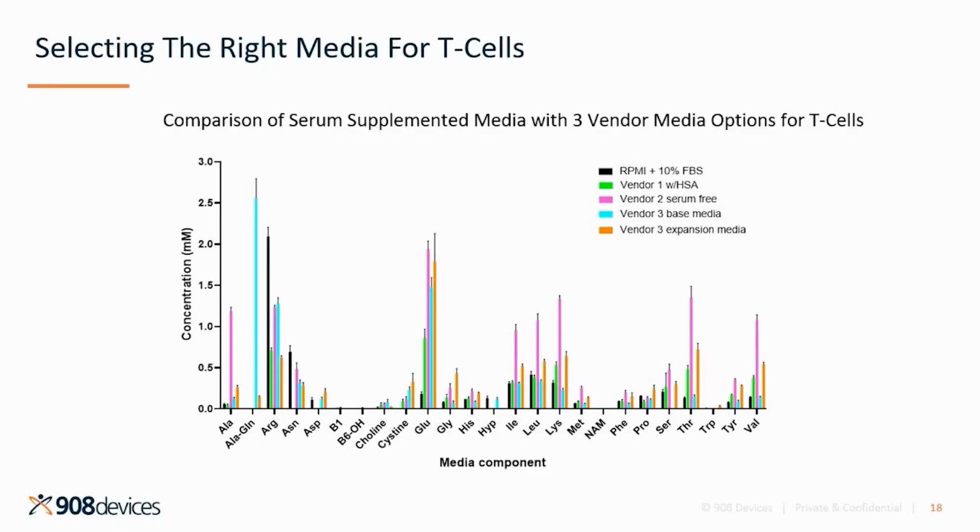On the left, we compared serum supplemented media with 3 vendors' media options for T cells. There are many options available on the market today, and they range from complete all-in-one media options to media that should be used exclusively only for early culturing or late expansion of T cells.